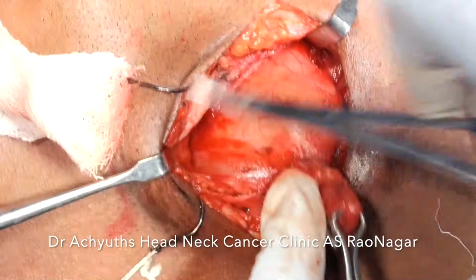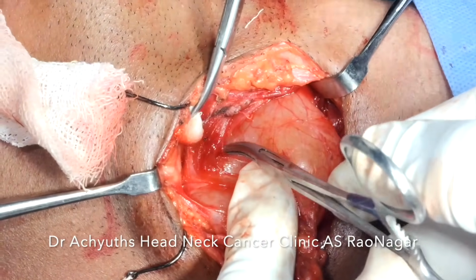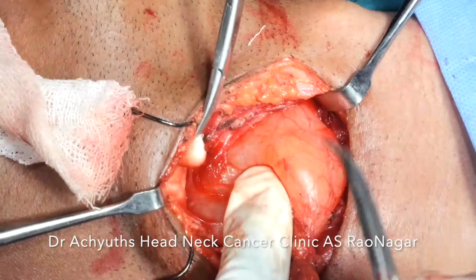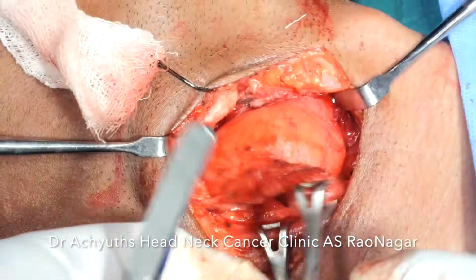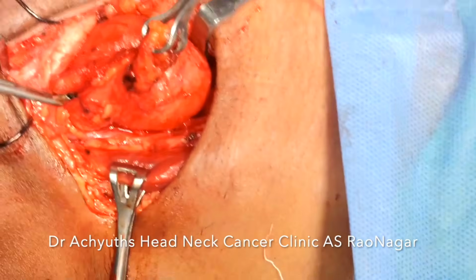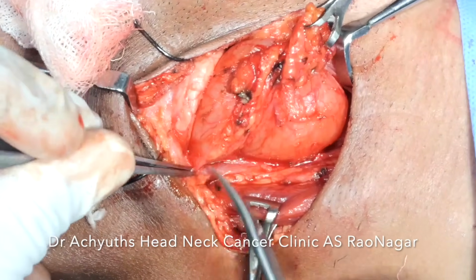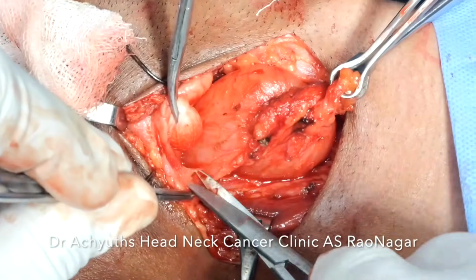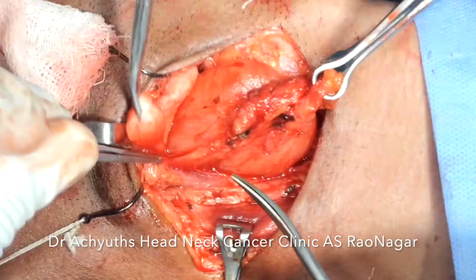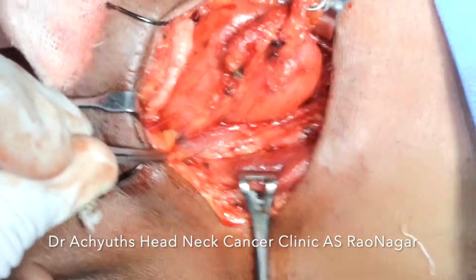So these things should be virtually done before we enter the OT. Whatever structures we are going to divide, and how we are going to go inside the endolarynx, should be initially imagined, because once you know what structures you are going to divide, you can also contemplate what kind of reconstruction should be done in these cases.